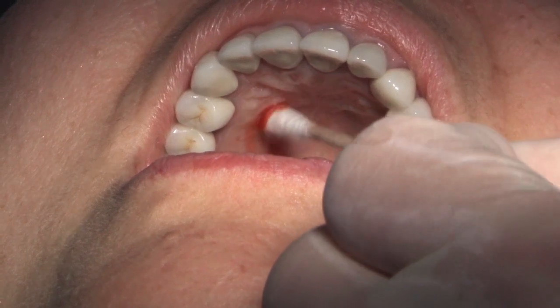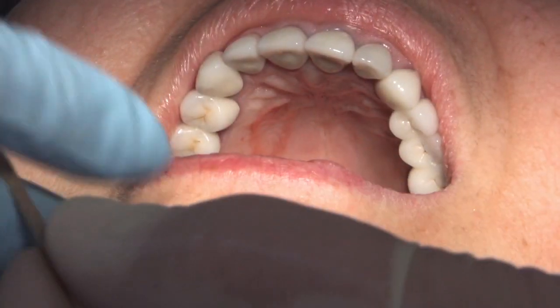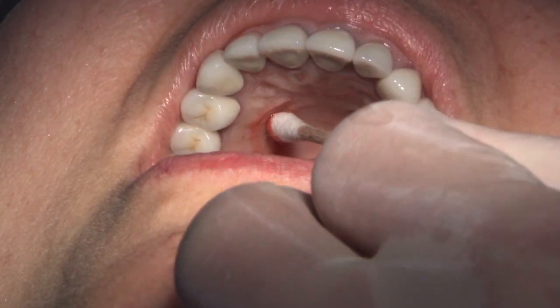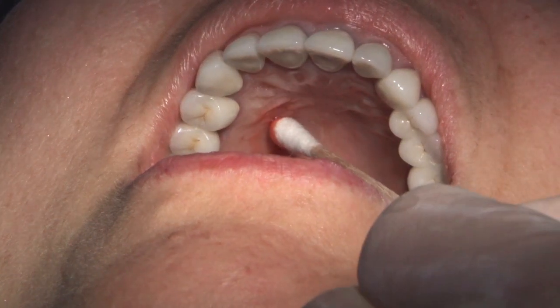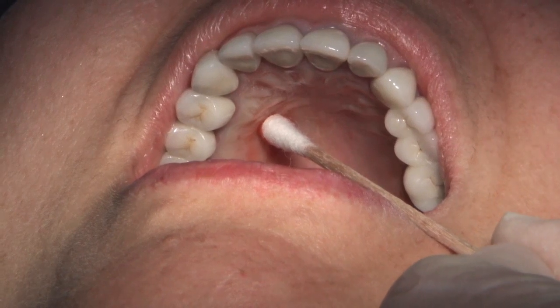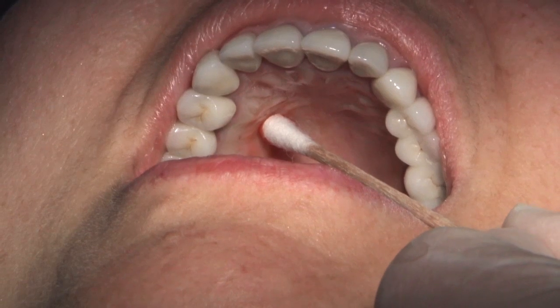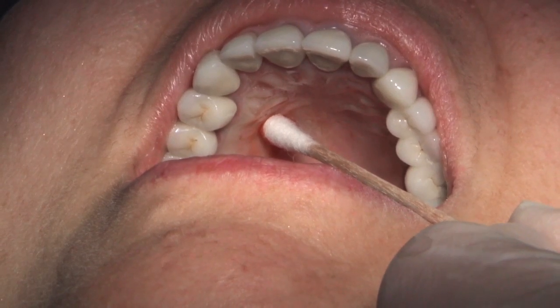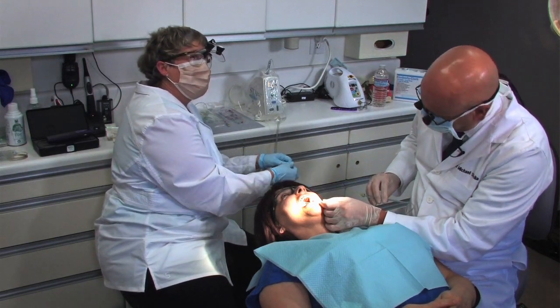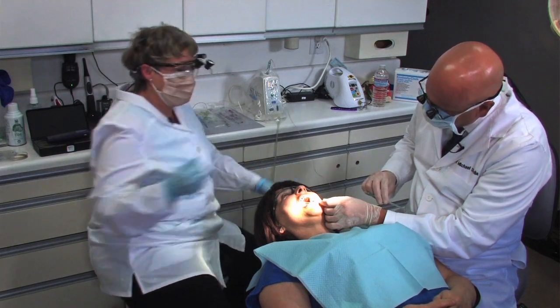All right, that's our first minute. Now I want you to go right back to the same place and put pressure in this exact same spot — enough that we'd actually see a small dimpling — and hold that for 60 seconds as well. Similar to what you might do for a greater palatine or other pressure anesthesia, just when you're ready, lift off the cotton and go right for the middle of your dimple.